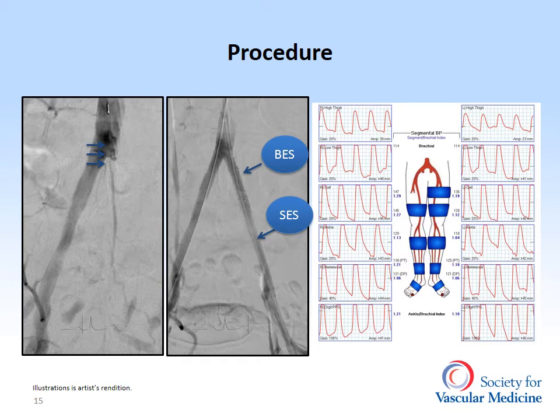Had a totally occluded common iliac artery. The interventionalist utilized a left radial artery access approach and placed a balloon expandable stent for better precision and radial strength in the common iliac artery, followed by a self-expanding stent overlapping into the external iliac artery. The decision to use two stents was based on limitations of currently available balloon expandable stents, with the longest on the market being 59 millimeters.